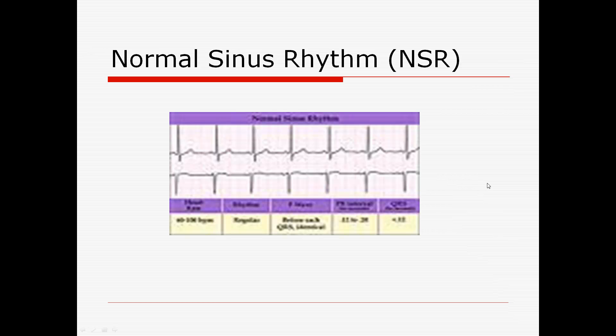Look at this — do we have a P wave in front of each QRS and a T? P wave in front of each QRS and a T? Yes we do. This is a normal sinus rhythm. If we add up the beats per minute on a six-second strip and add up the QRS complexes, we have 70 beats per minute.